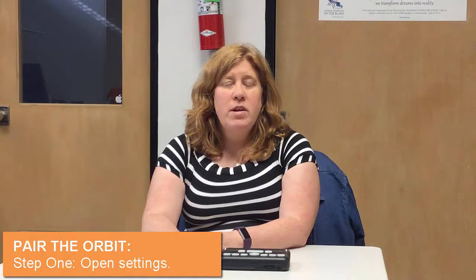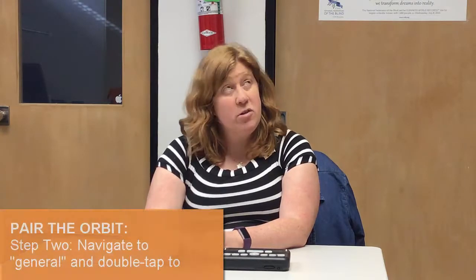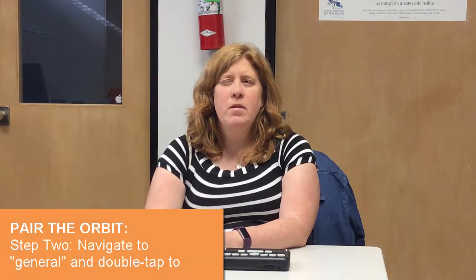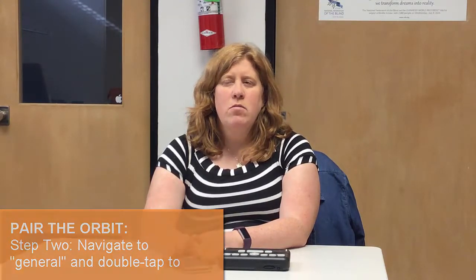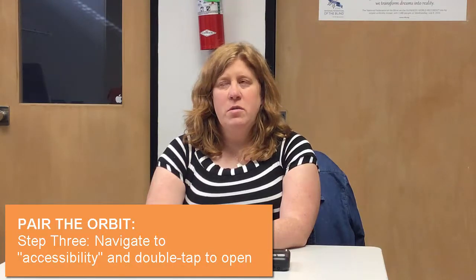Now in Settings, we need to go to Accessibility — or actually we need to go to General first. Now we found the General settings, so we're going to double tap. Now we're in Settings, so now we have to find Accessibility. And here it is. Double tap.